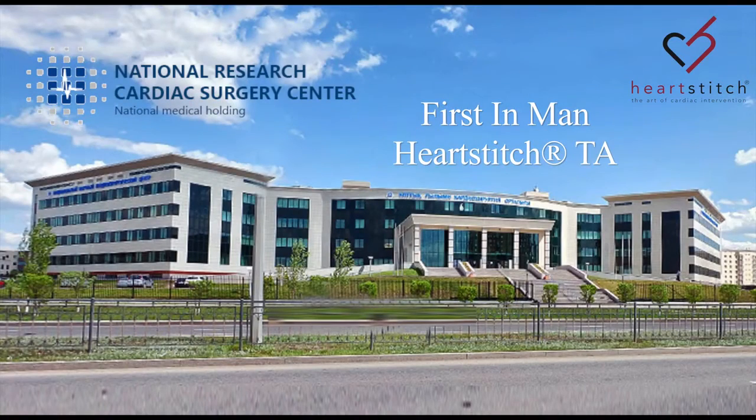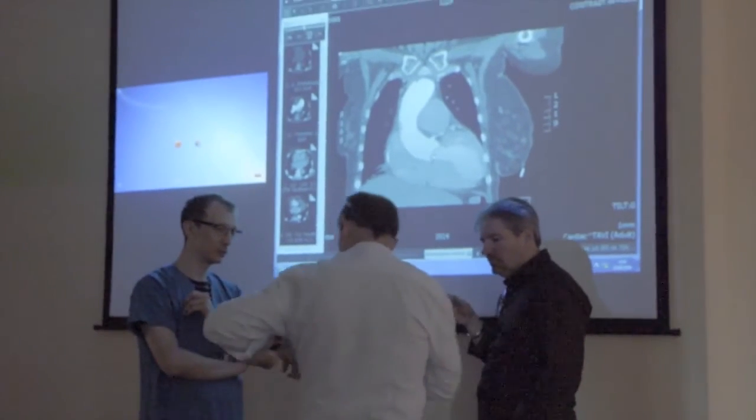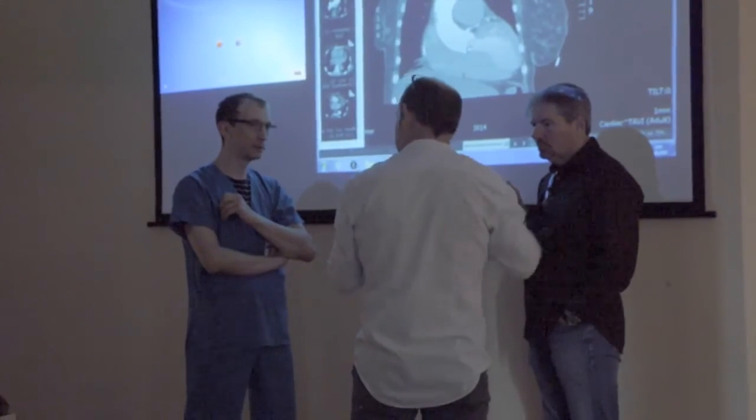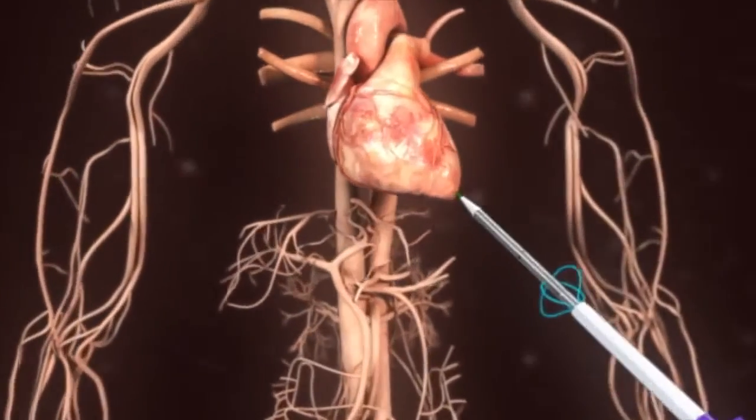This video demonstrates the first in man of the HeartStitch Transapical Access Enclosure Device, or HeartStitch TA. These initial cases were performed at the National Cardiac Surgery Center in Astana, Kazakhstan. Dr. Michael Mullin and Professor Anthony Nobles, along with a team of talented surgeons and interventional cardiologists at the National Cardiac Center, led by Dr. Yuri Pia, CEO of the hospital, performed these initial cases.